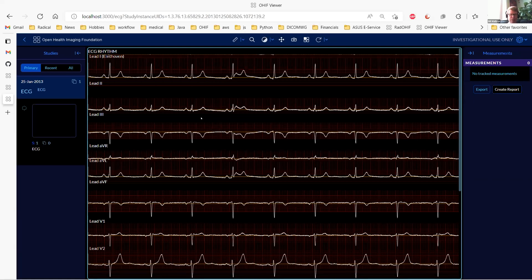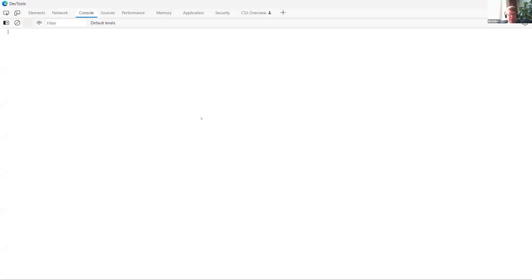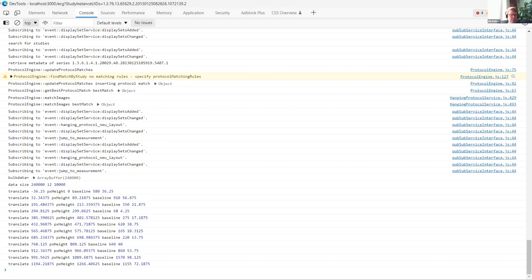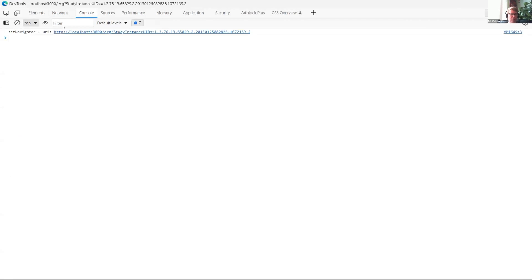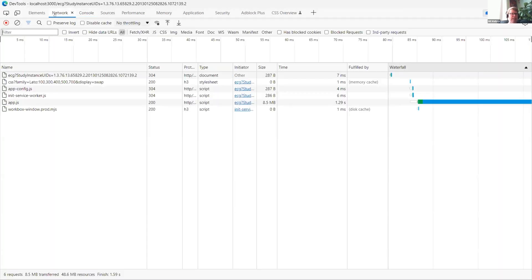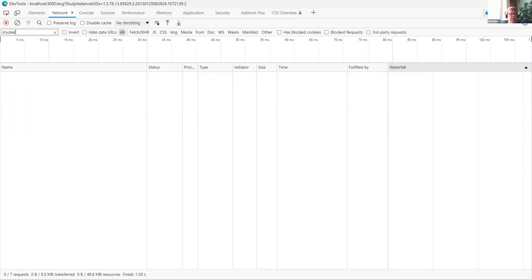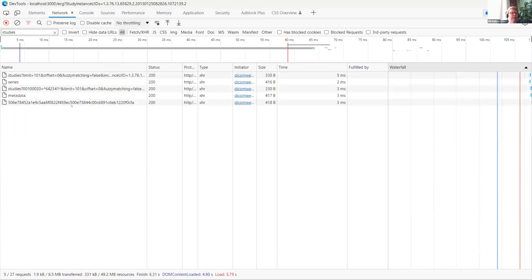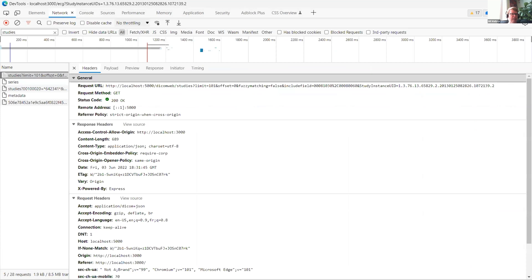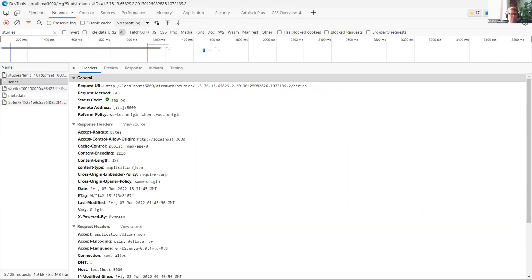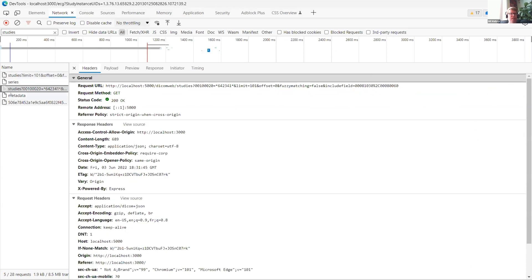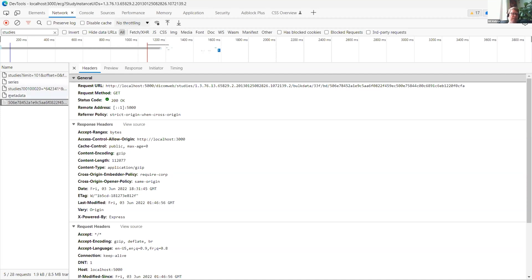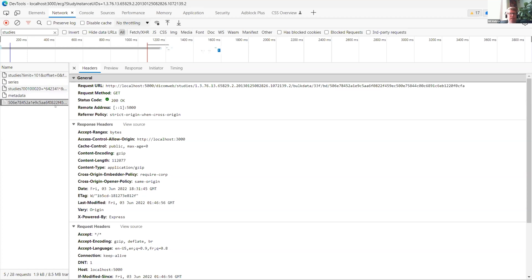Any questions about this? I can just show the actual requests that get made. So there's a study query to query for things here, then it does a series query, queries for and gets the metadata. So this is the metadata, and this is a bulk data URI. So this is the binary data for the actual waveforms.